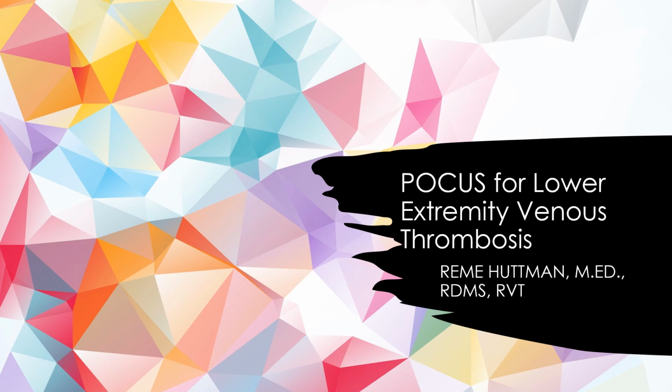We're going to look at point-of-care ultrasound for lower extremity venous thrombosis. So you have taken a number of different lectures leading up to this. Hopefully all of that background information will make this a really simple process to learn and understand. So we'll get right to it.